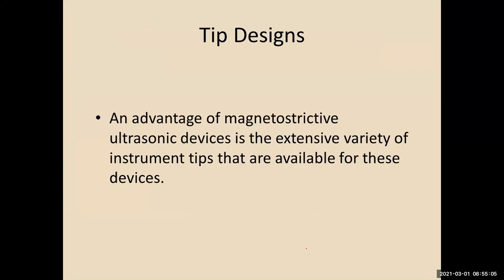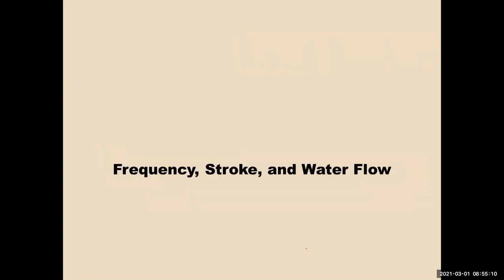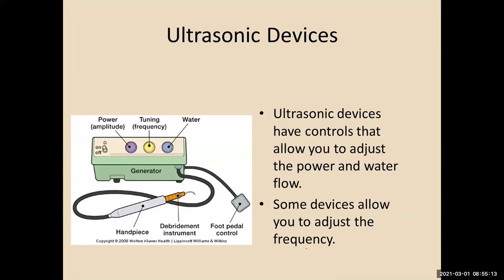We have all sorts of different insert and tip designs. They're making more all the time, so you can reach almost everywhere. We want you to be comfortable with the right and the left and the triple bend by the time you graduate, so you know how to use them and can get full access to whatever the patient presents with. But ultrasonics have controls. They're either built into the unit itself as far as the chair, or you've got a separate unit.